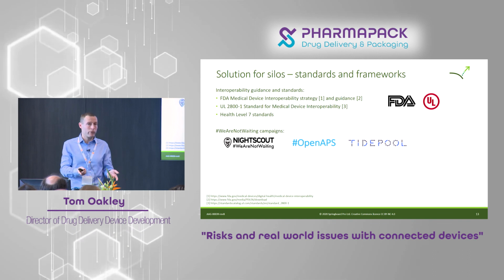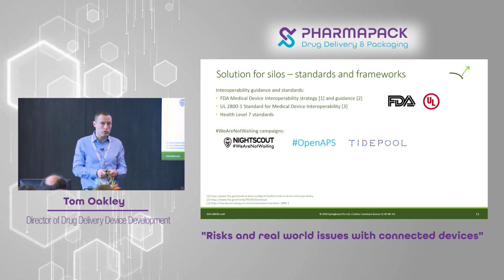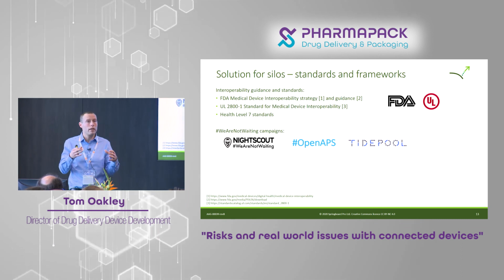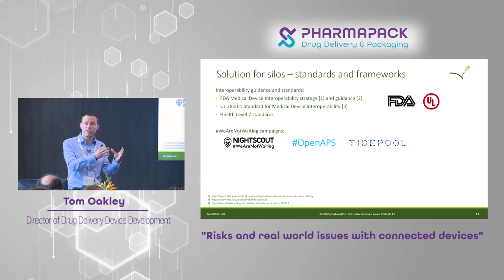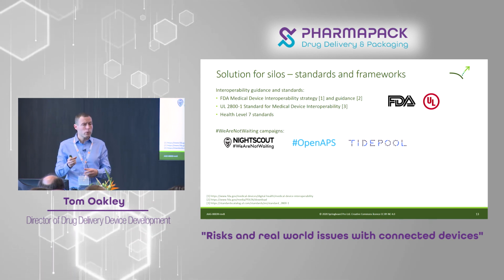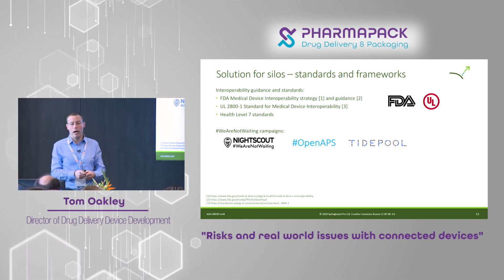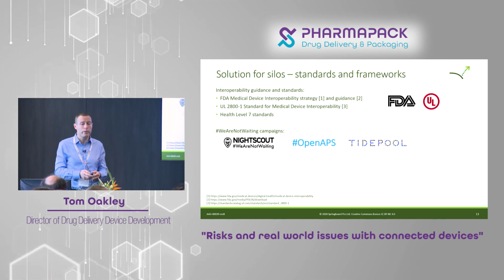APS stands for Artificial Pancreas System, so it's the closed-loop insulin delivery. And there's a non-profit organization called Tidepool, which is taking those technologies, putting them together, and getting them FDA approved. So their raison d'etre is to go and have these kind of grassroots technologies approved officially, so that then they can recommend to people, you should actually do this, it does work. Tidepool's actually getting some momentum now. So for example, Dexcom, probably the most significant continuous glucose meter, has signed up to be an open CGM. And Tandem on the pump side has done that, and various others in the industry are looking into this as well. So it's a real movement that's happening.